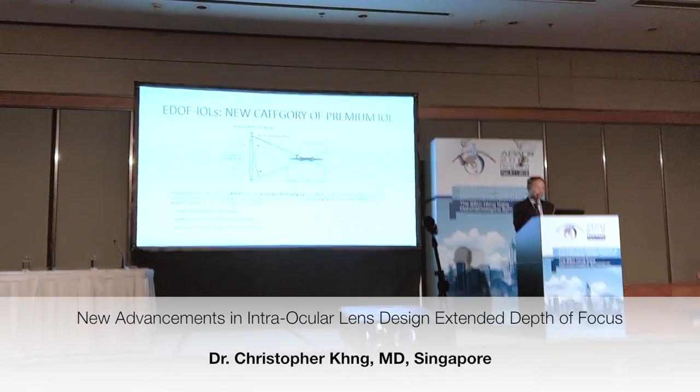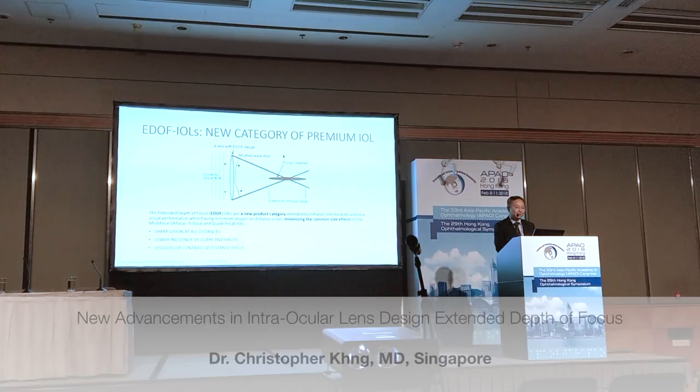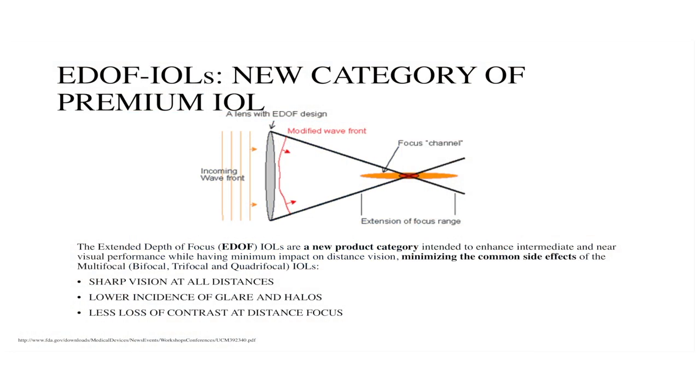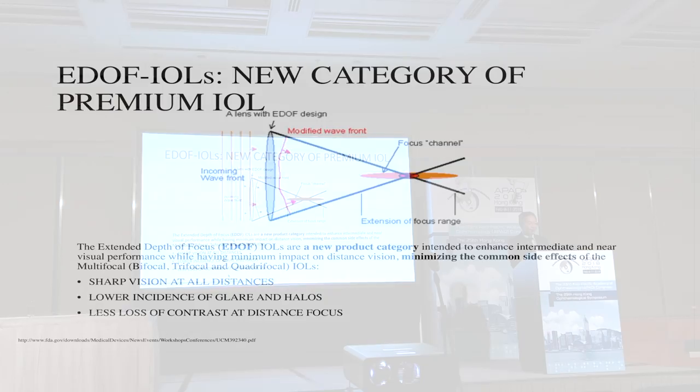Extended depth of focus IOLs are a new premium category of the IOL. We have to get away from the diffractive multifocals and refractive multifocals. The new category works on the wavefront of the lens, and through altering the wavefront, you can end up with a focus channel which extends depth of field. What this gives us is sharp vision at all distances, a low incidence of glare and halos, and less contrast loss.